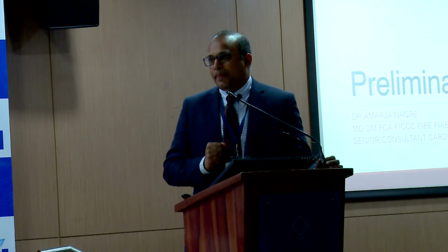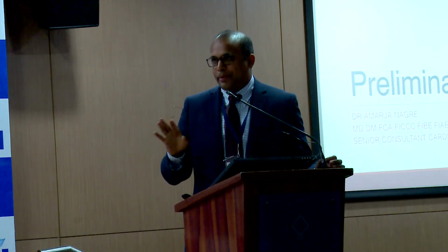And I think most importantly with LV diastology, the right ventricular pressures, that's to be kept in mind. Yeah, because the RV is much harder to protect than the left side. And you're right, the perioperative period is such a dynamic event that what you see at one particular cross section may completely change in 5 minutes. Which is why in most perioperative echo reports at my institution, the LV diastolic dysfunction is indeterminate. So you can't determine it.